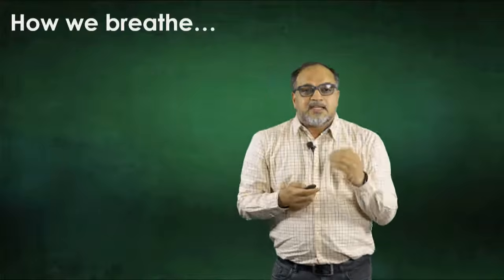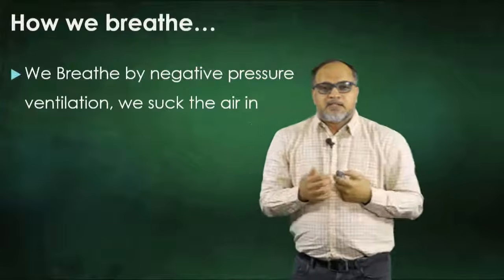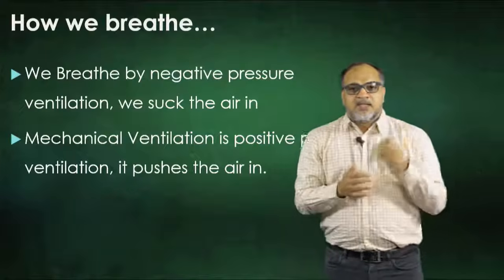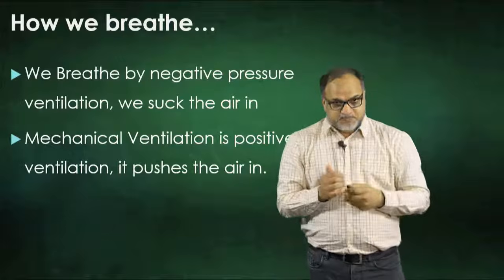When we normally breathe, we take the air in, we suck the air in, it is negative pressure ventilation. We create a vacuum inside our lungs and we suck the air in. That is called negative pressure ventilation. The normal routine breathing is negative pressure ventilation. While when we actually ventilate a person, it is not negative pressure ventilation, we blow the air into the patient. Right. So mechanical ventilation is positive pressure ventilation and it pushes the air in. Agreed?